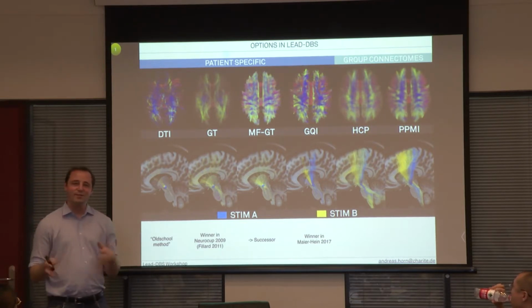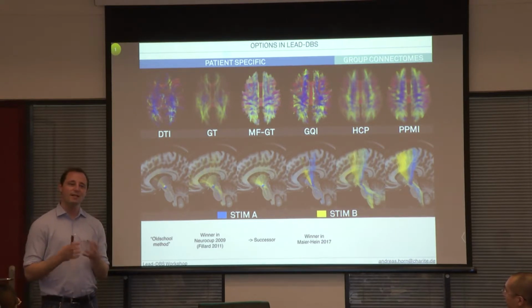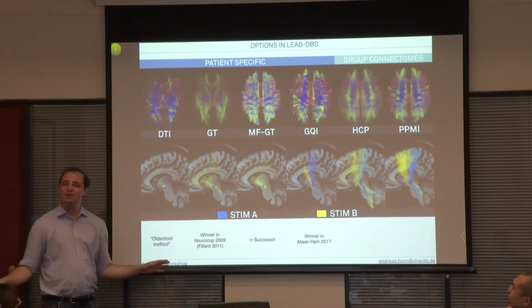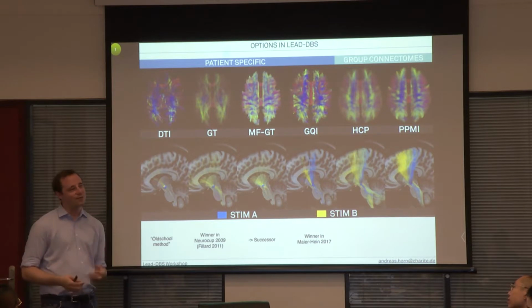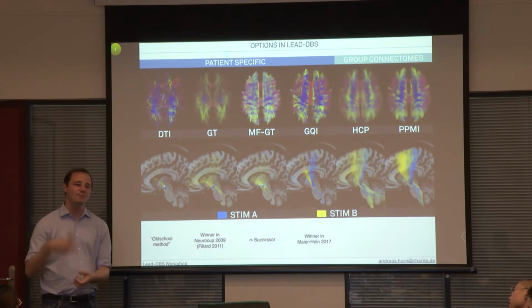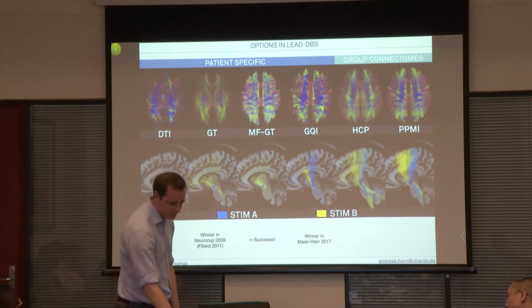It has a lot of the same problems that we discussed before, like seed bias and length bias, but some of them are a little bit attenuated, because first you track all fibers without knowing the question, you just want a reconstruction of the whole brain, and then you select the fibers. If you instead would track from the VTA, the algorithm would specialize on the VTA maybe. But if you do it without that first and then select them, there might be a bit of advantage.